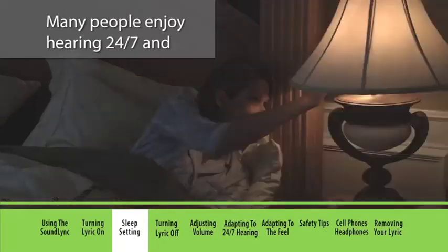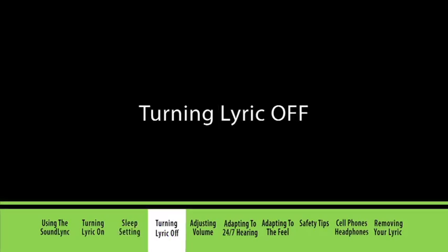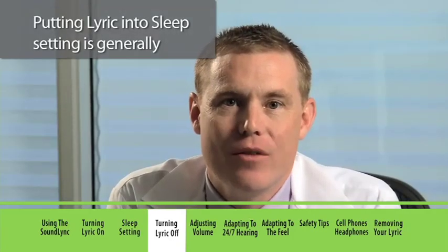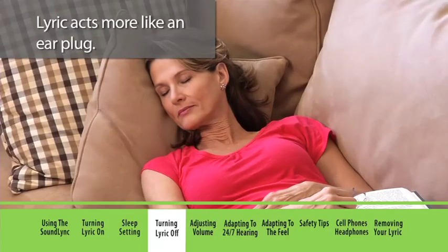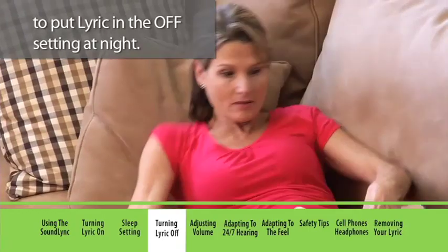Many people enjoy hearing 24-7 and choose not to use the sleep setting. Putting Lyric into sleep setting is generally preferable to turning it completely off. In the off setting, Lyric acts more like an ear plug. If you live alone, it could be dangerous to put Lyric in the off setting at night.